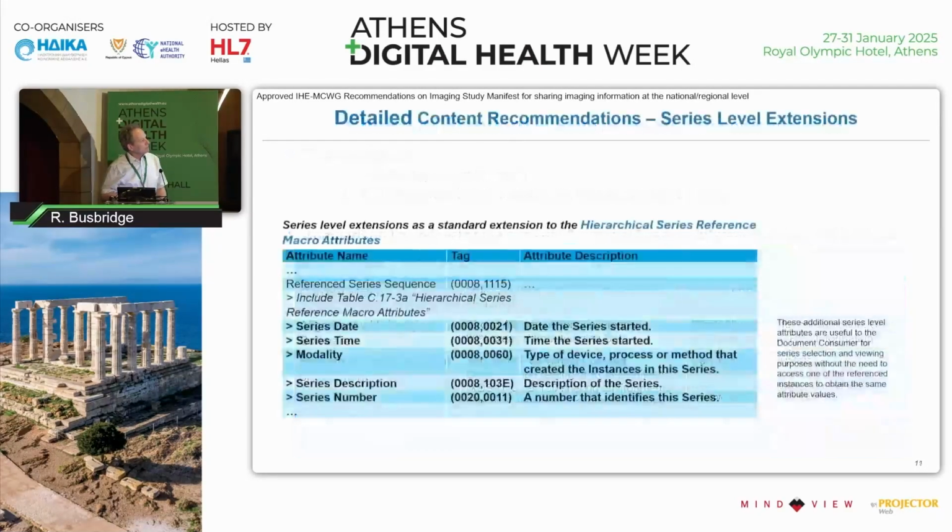What we've then done, and this is an abbreviation of the full slide deck, which has about 30 or 40 slides on the recommendations, is talk about some of the missing attributes that we feel should be added to the standard definition of a DICOM KOS. We add those in as essentially optional attributes in terms of DICOM. We don't want to break the DICOM standard, so we have to be very careful about adding information that wasn't there originally. We can't mandate the use of these attributes in the formal DICOM definition, but we can recommend that they are used. IHE have done this as well in their use of certain DICOM objects, making recommendations that slightly enhance the use of a standard DICOM object.